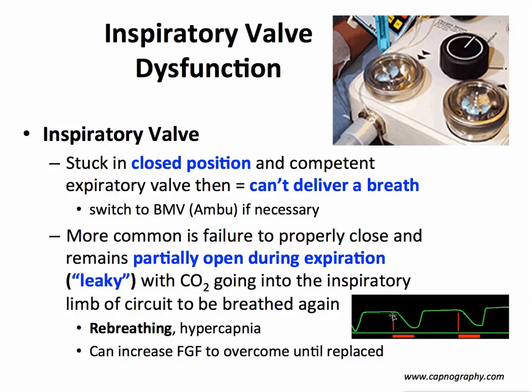And if you look at the red vertical line here, you can see at the end of expiration, at the beginning of inspiration, notice that there's carbon dioxide in it and you don't have the normal square waveform, but a sloping off of that CO2 curve, indicative of an inspiratory valve malfunction, and the baseline being up, evidence of rebreathing.